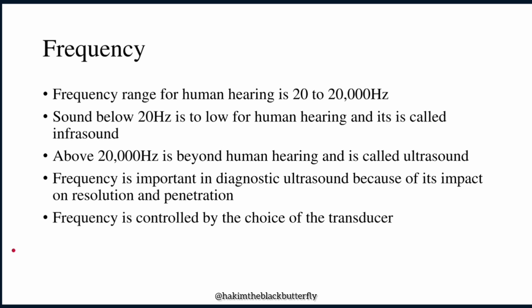Some people confuse frequency with energy. When you talk about high frequency, they think that high frequency penetrates deeper because it is high. Frequency is different from energy. When the energy of the beam is high, yes, it can go far. But I'm talking about frequency, which is just vibration, the number of times the beam vibrates or the molecules vibrate per second. The higher the frequency, the better the image resolution, the poorer the penetration. The lower the frequency, the poorer the resolution of the image, the deeper the penetration.